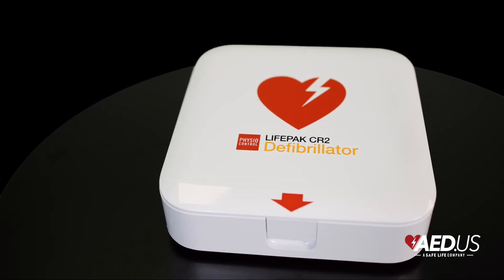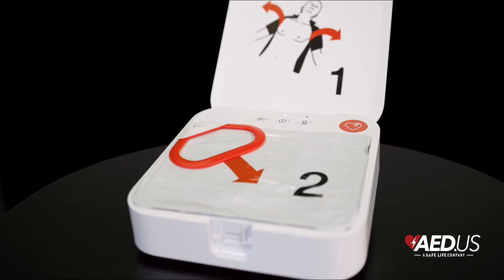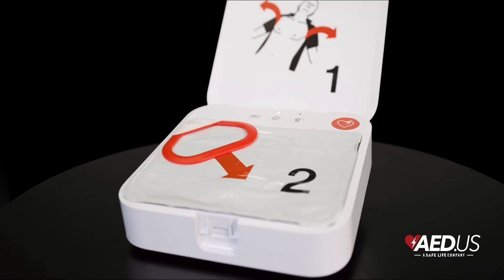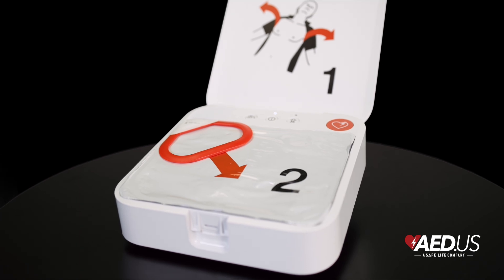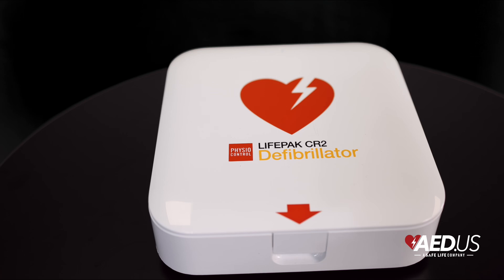Ease of use is at the heart of the CR2's design. It features clear graphics and voice instructions to walk you through each step so you're never guessing what to do. The quick-set pads peel off the base in seconds, because no one wants to be wasting time wrestling sticky pads in an emergency. It eliminates unnecessary pauses so you can keep the momentum going when it matters the most.